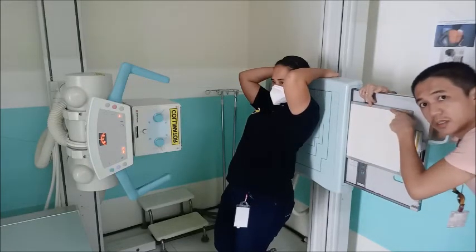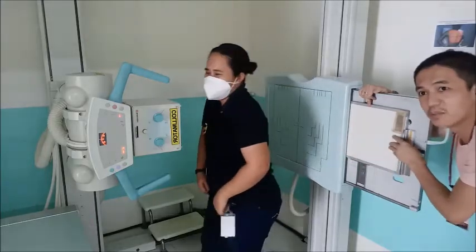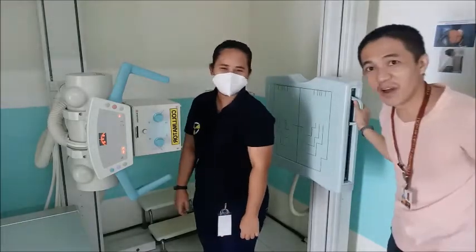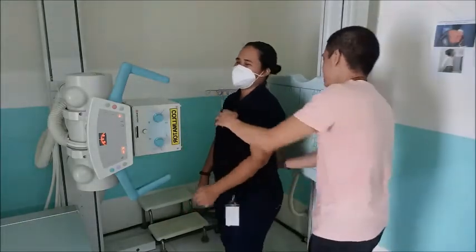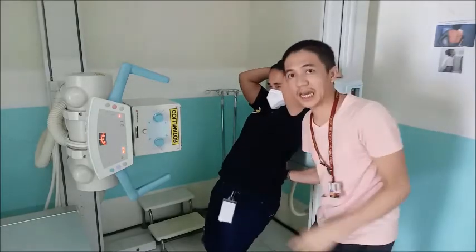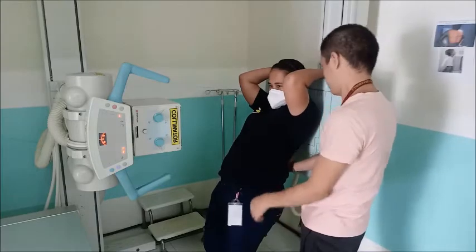So top of the shoulder, and then kani siya is approximately nasa ikapon sa patient. Diba? Haway na siya na positioning. Ayan siya. Okay.